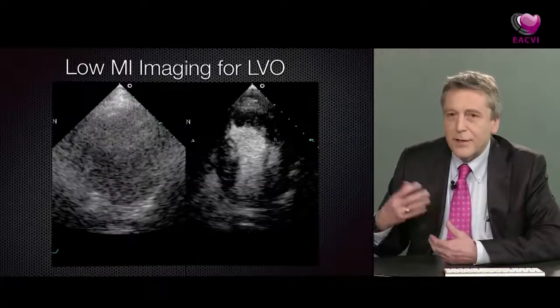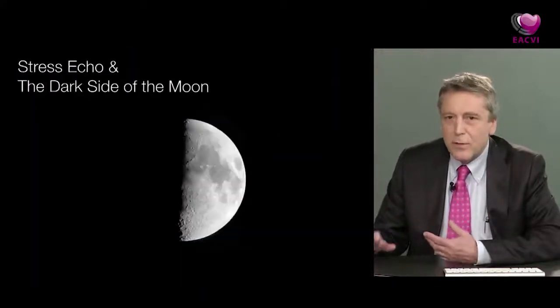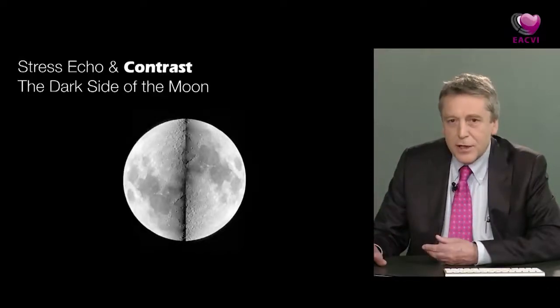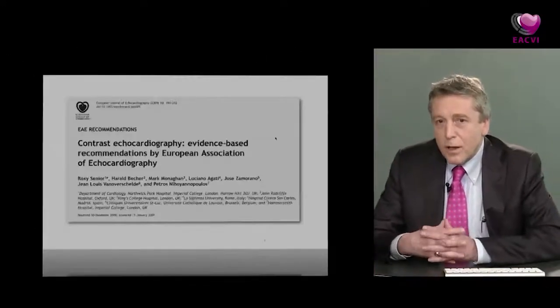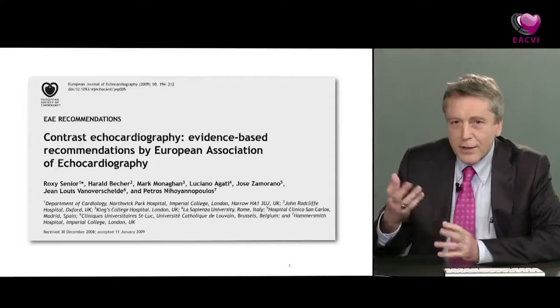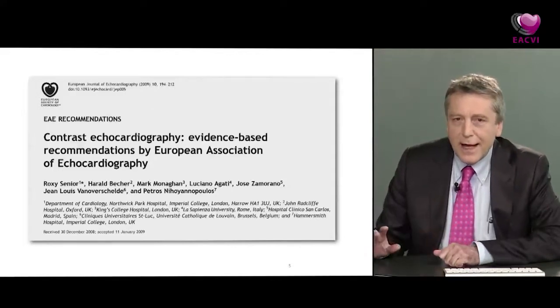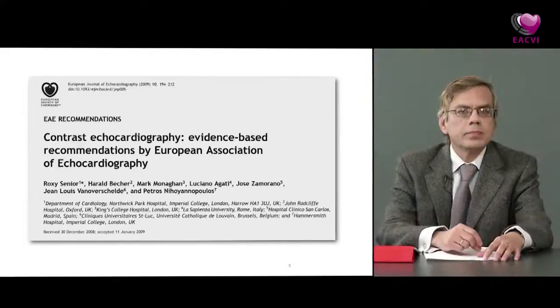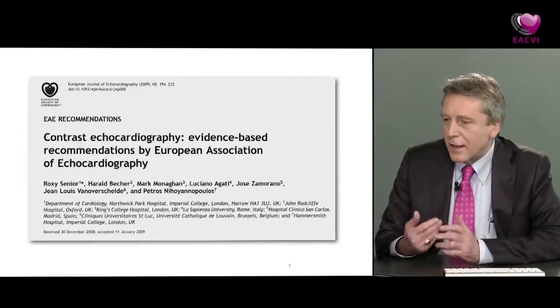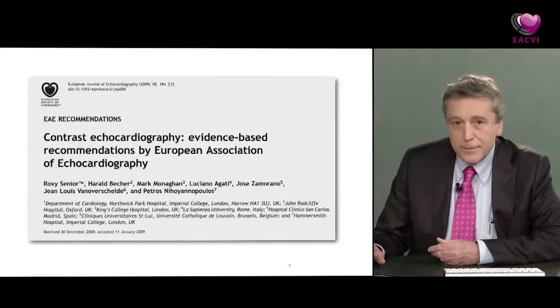And I like to think of it as looking at the dark side of the moon. When we add a contrast agent, we can take a stress echo image of the type I showed you and make it interpretable. Now, you and I both worked on these evidence-based recommendations produced by the European Association. In fact, you led the group on this. And part of the presentation that we're going to be discussing today is based upon these recommendations and looking at how they can be practically applied.